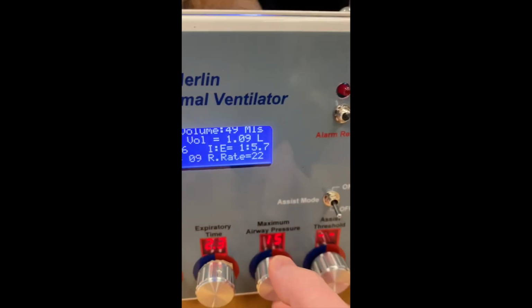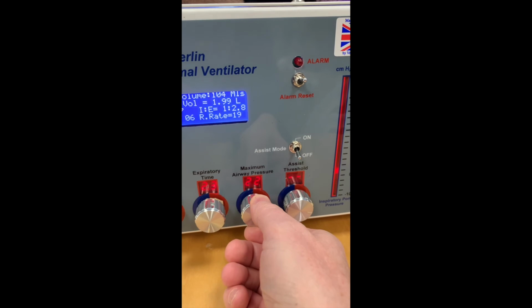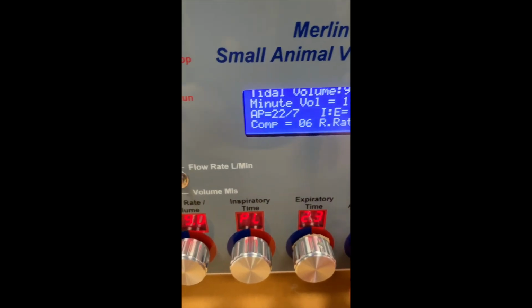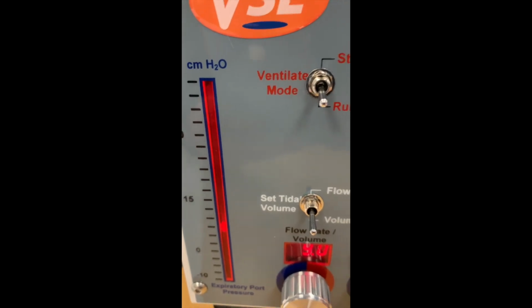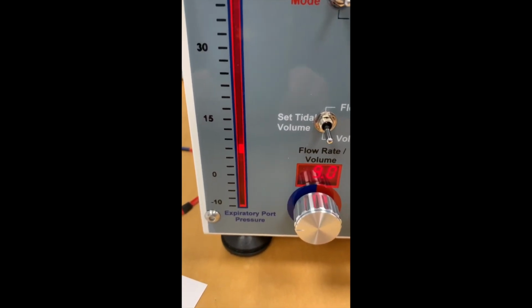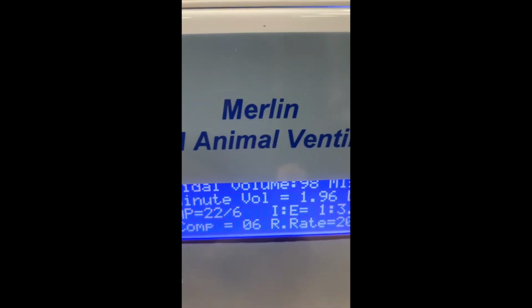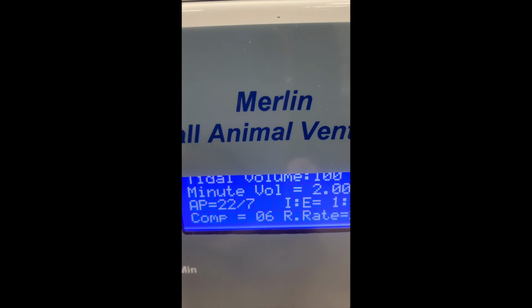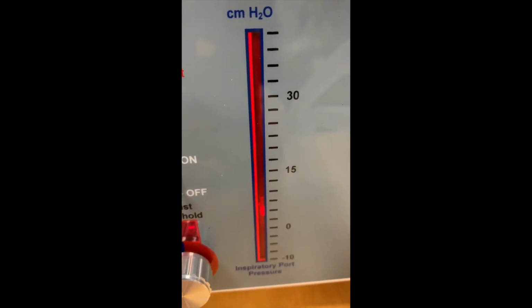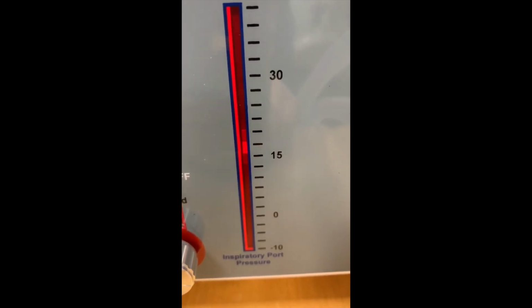Okay, I'm going to increase the maximum pressure now so that we have a bit more of a threshold above the PEEP value. So you see now that we have on the expiratory limb bar graph a non-return to zero indicating the PEEP. The actual value is shown on the screen. And on the inspiratory side, we obviously have a return to zero because we have no retained pressure there.